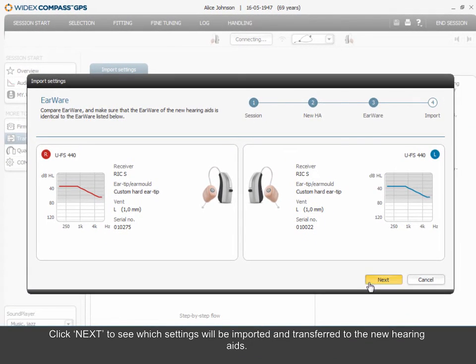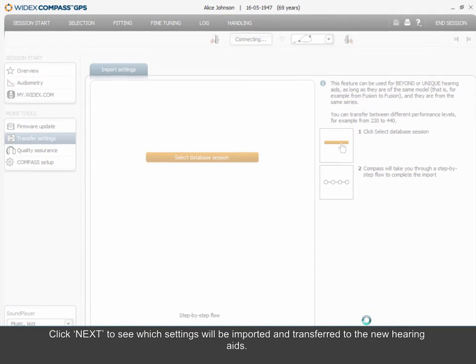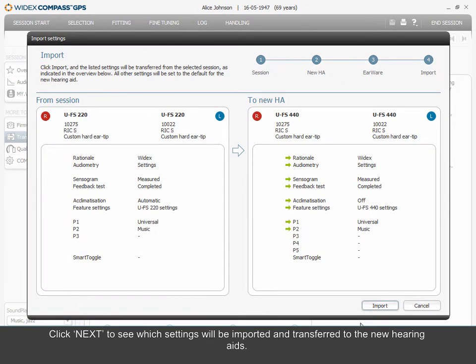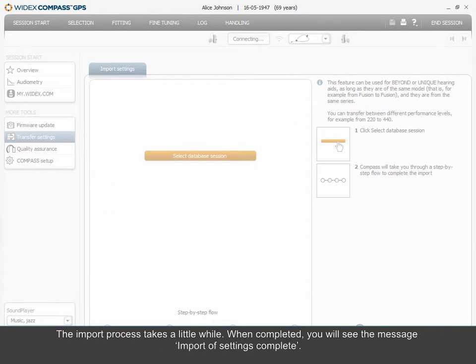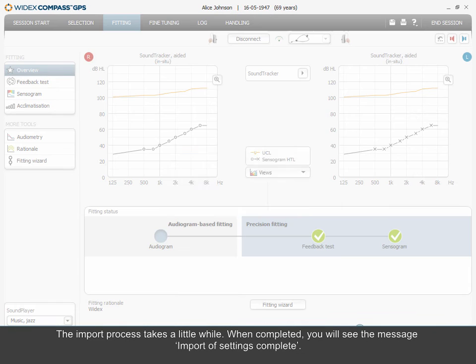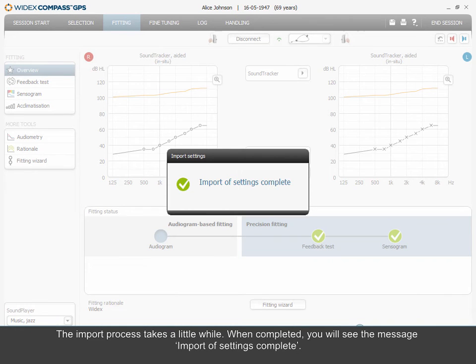Click Next to see which settings will be imported and transferred to the new hearing aids. Click Import to transfer the data to the new hearing aids. All original settings in the new hearing aids will be overwritten. The import process takes a little while. When completed, you will see the message: Import of settings complete.